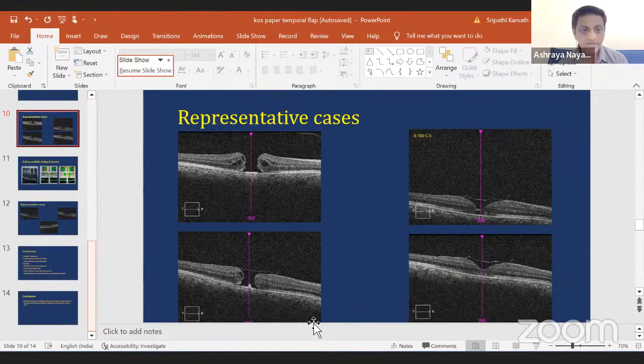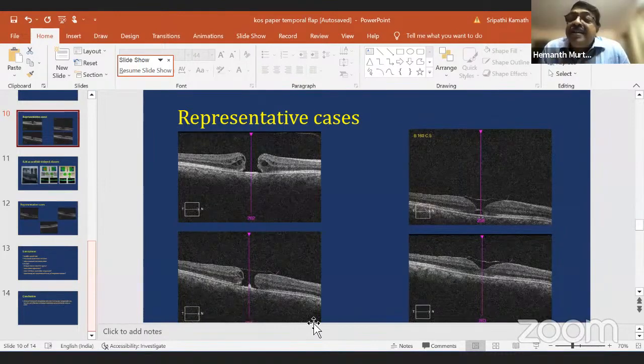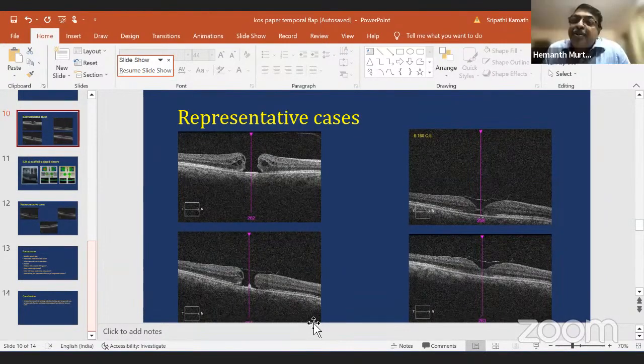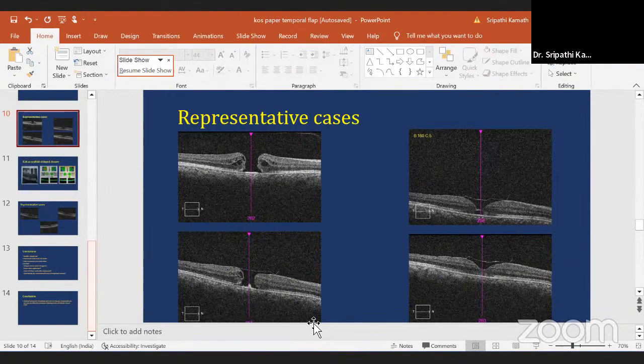Sir, but in a vitrectomized eye, even if it quadruples, 0.3 cc will be 1.2, and the arc of contact, with only 3 hours of prone positioning you are giving. So does this tamponade really make a difference to the patient, or could you have as well used air and spared even that 0.3 cc of gas? No, Ashray, this is not just one bubble. This is an eye filled with air in which he's injecting C3F8. So now it gets diluted to about 12-13%, if I'm not mistaken, about 10 to 12%.